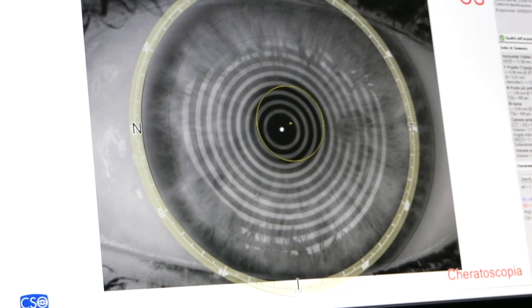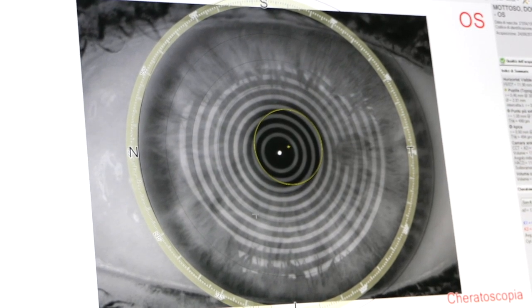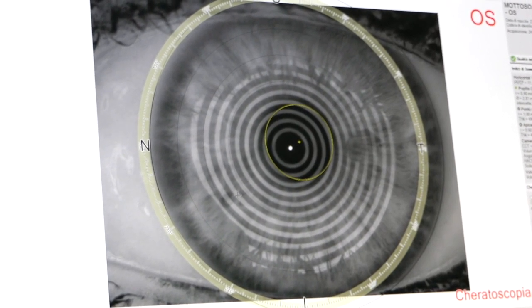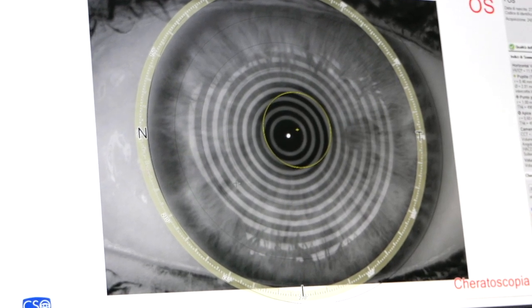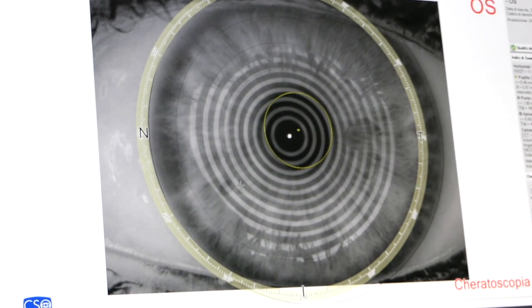The larger the reflected circles are, the more the cornea is flat. This is the principle on which the Placidus disk is based.